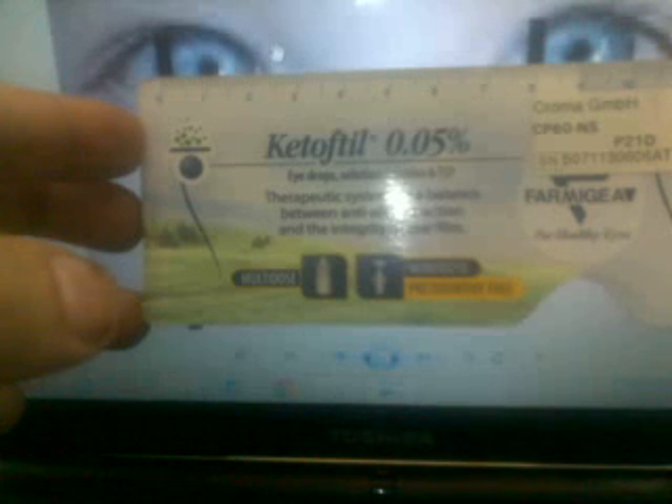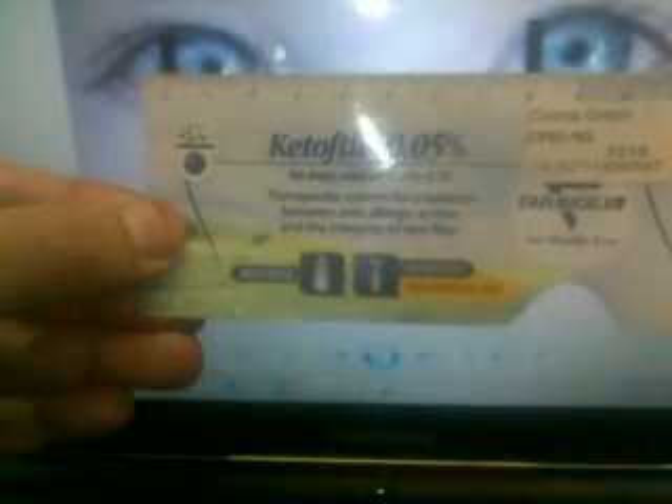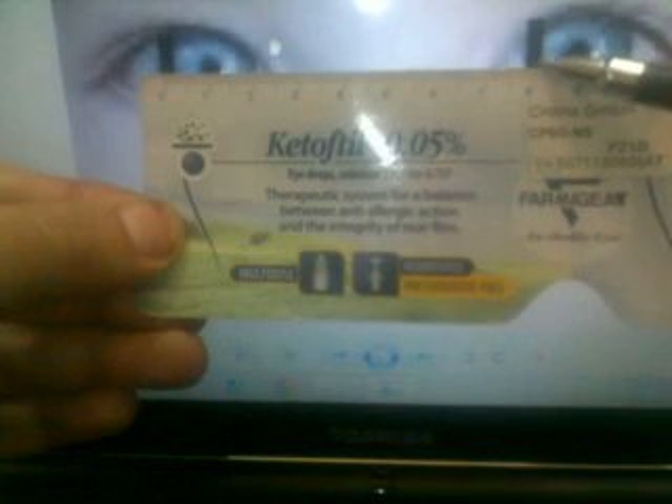Ask the patient to look at your left eye. Then shift to the left eye of the patient, asking the patient to look at your right eye. You will then take the accurate measurement at that point.